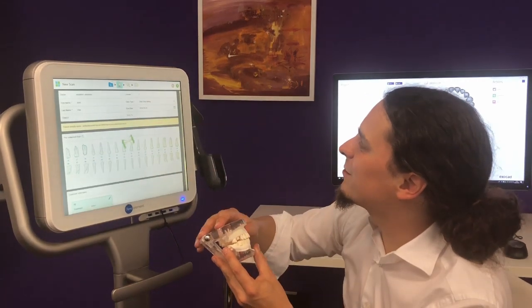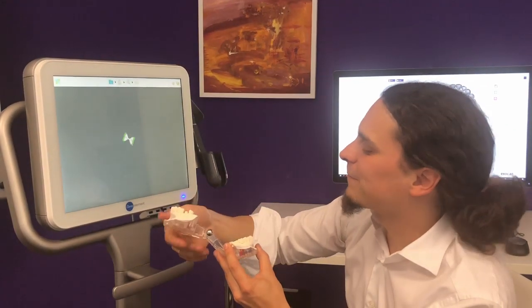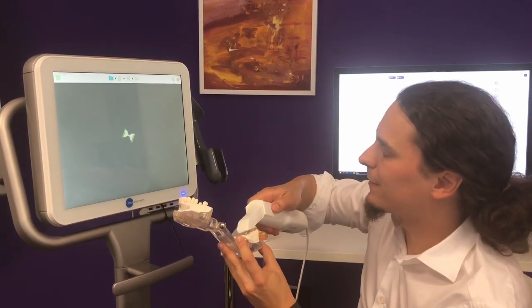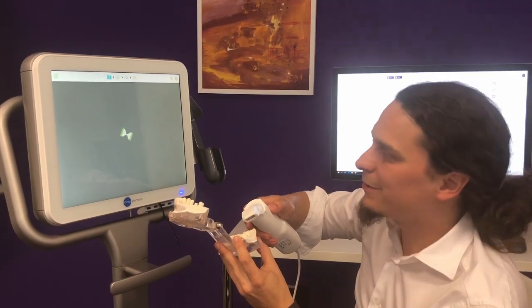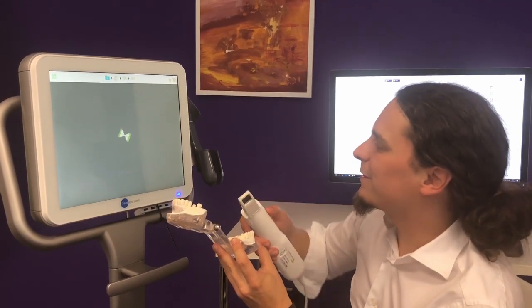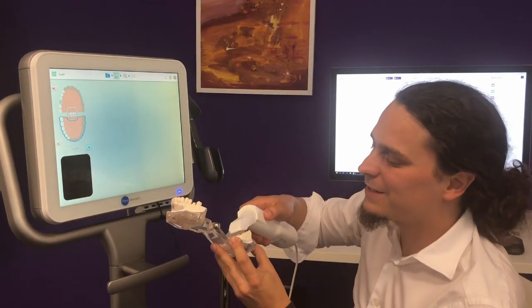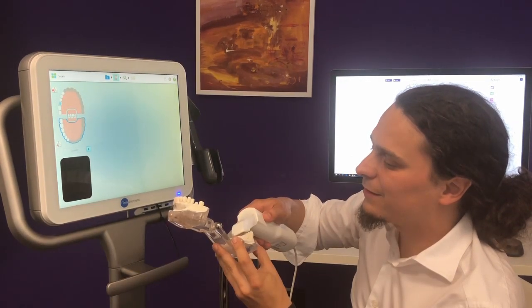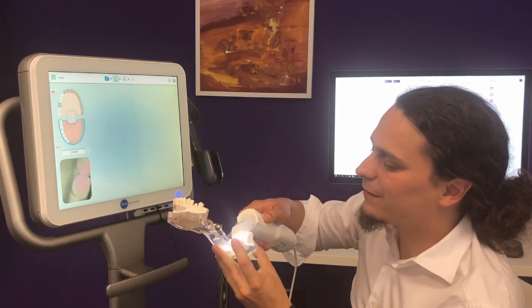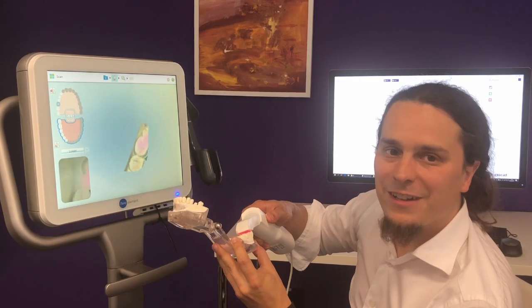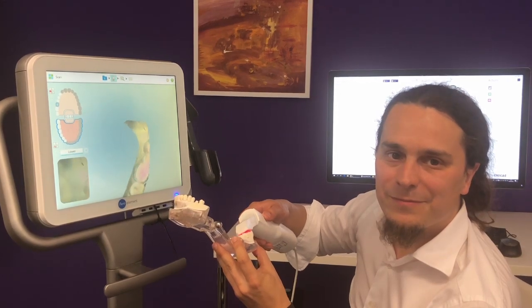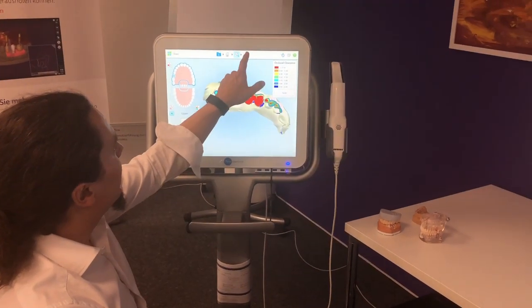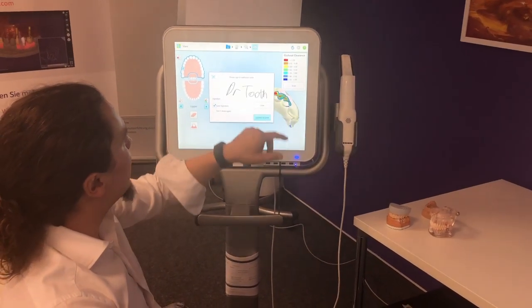Now we'll proceed to the scanning. As an iTero user you're certainly familiar with the scanning process, so I'll skip right to the end. The scanning is done and I'll hit the send button.